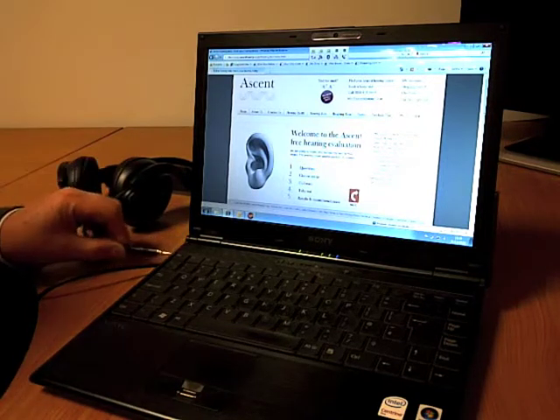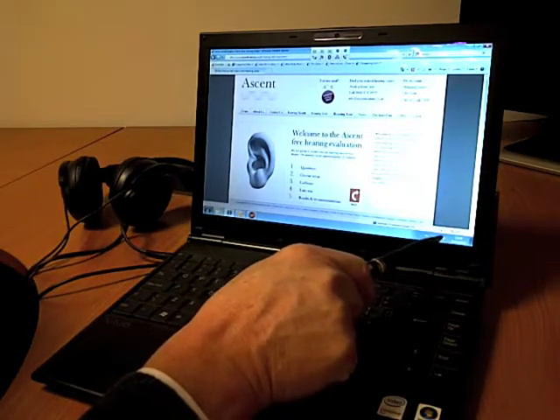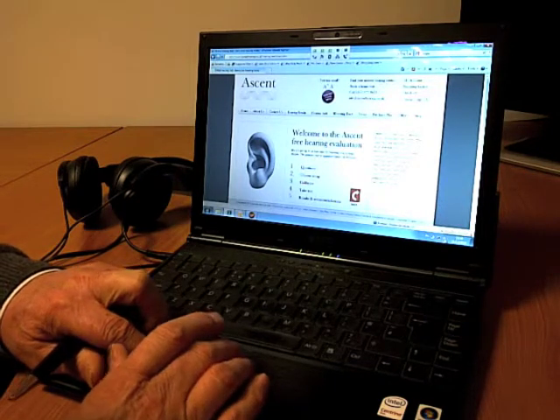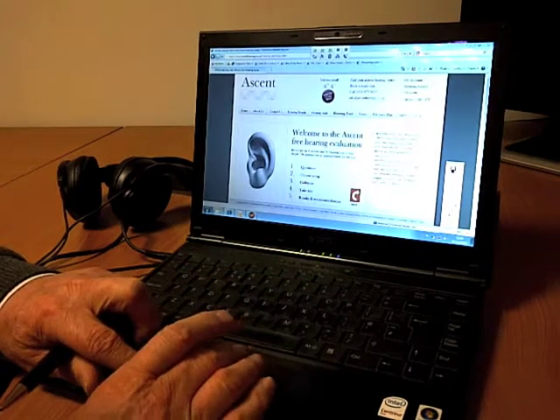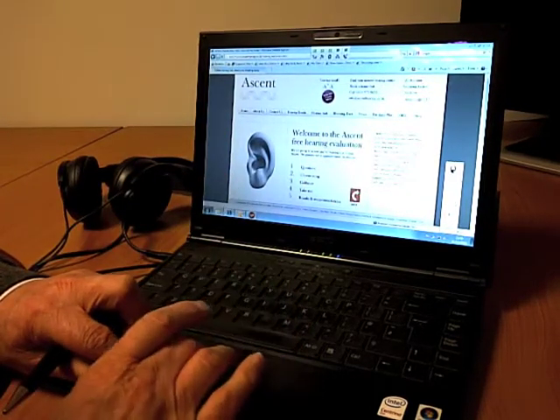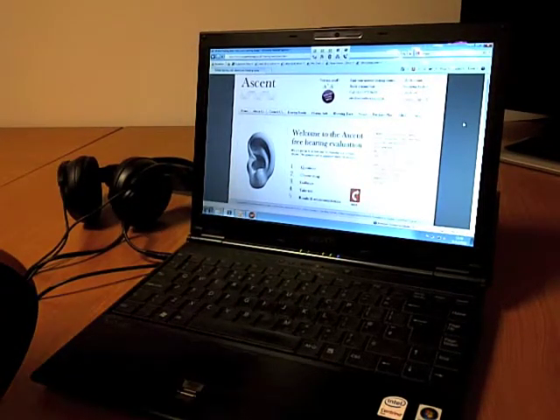So make sure that you plug them in to your headphone socket, in this case here on the side. And also at the bottom of the screen, make sure, in this particular case it's here, that the sound is actually set at normal comfort levels that you would wear it. In other words, you're not muted for any reason. I quite often mute my sound, particularly late at night when I'm pottering away on my website, so that I don't disturb my wife who might be asleep next to me. So just basic common sense things like that will help.